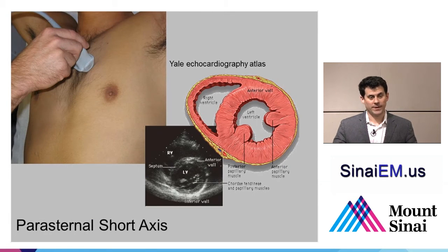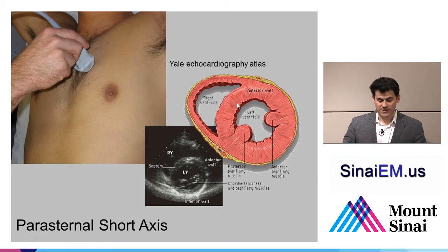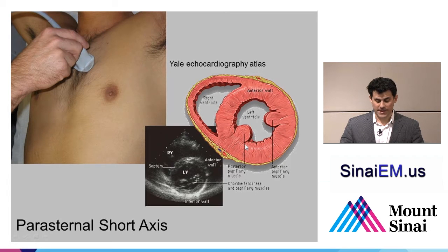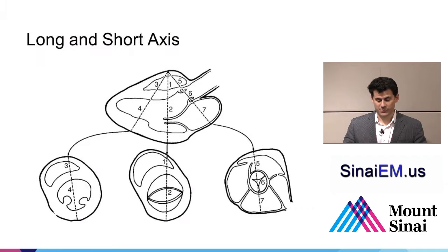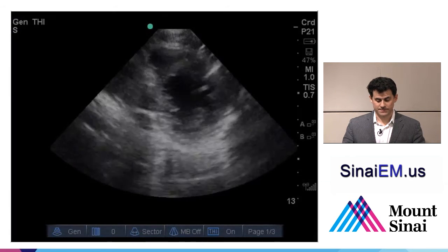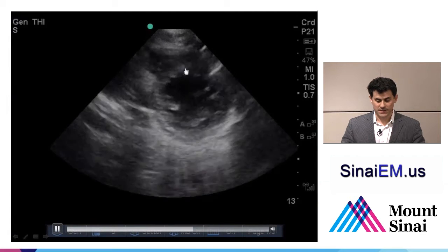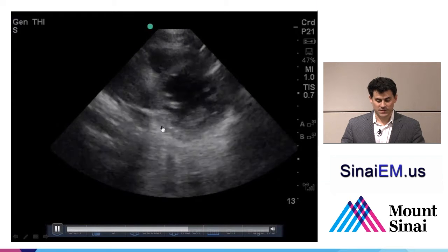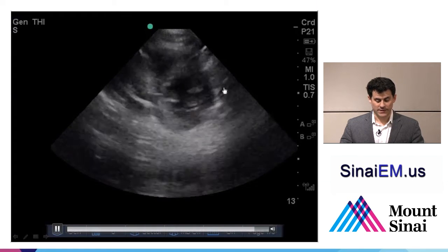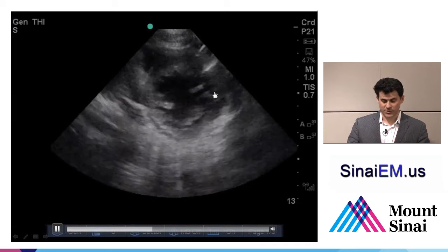For the short axis, you rotate the probe 90 degrees and now you're slicing through a transverse view of the left ventricle. We can see the anterior wall up here, the septum, and the posterior wall. Typically this is viewed through the level of the papillary muscles, and it's an excellent view to look at contractility circumferentially. We see the septum separating the left ventricle from the right ventricle, and the heart beating concentrically towards the center, demonstrating good contractility.